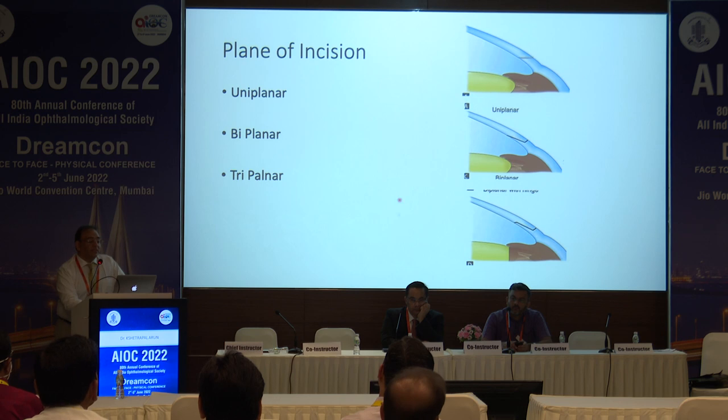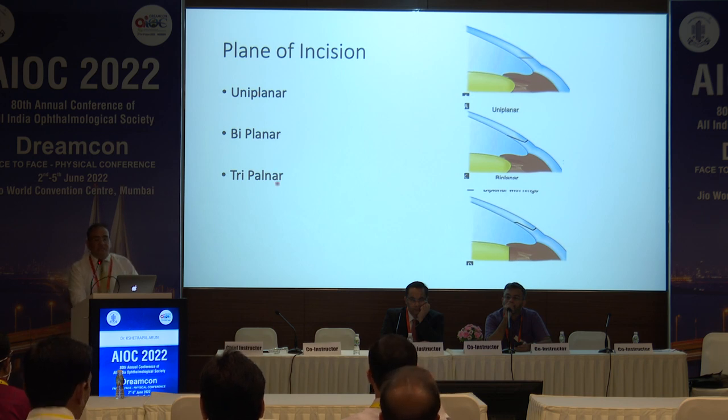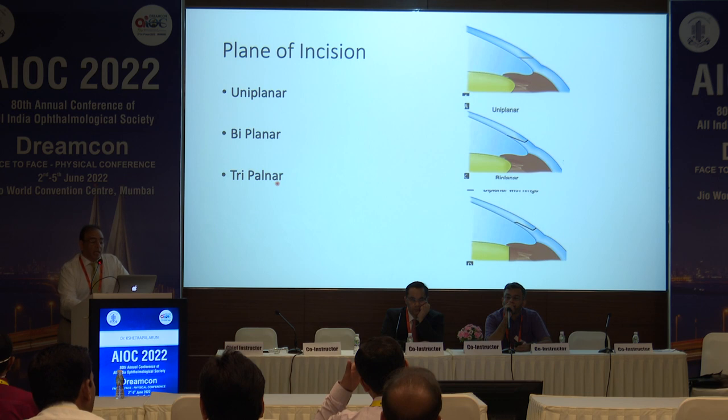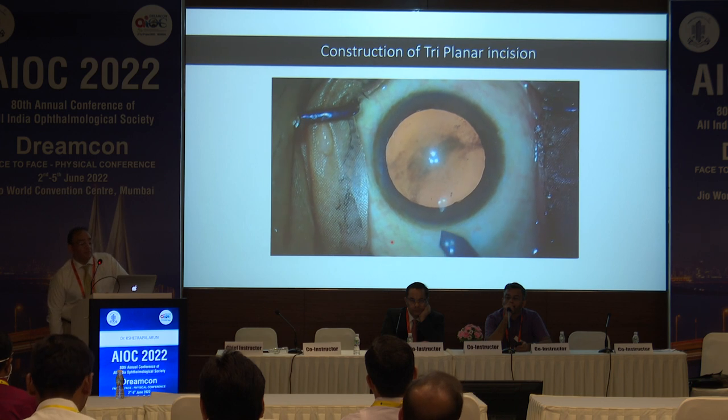Coming to the plane of the incision, as I just told you, you can have a uniplanar, a biplanar, or a triplanar. Triplanar incisions are the best incision. They are the least leaking, snug incisions.